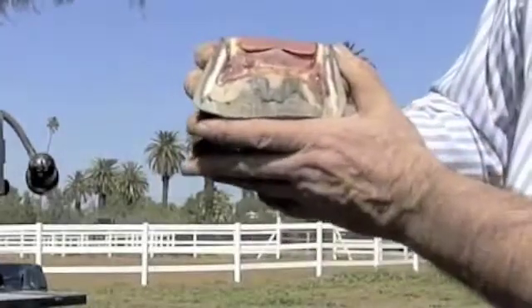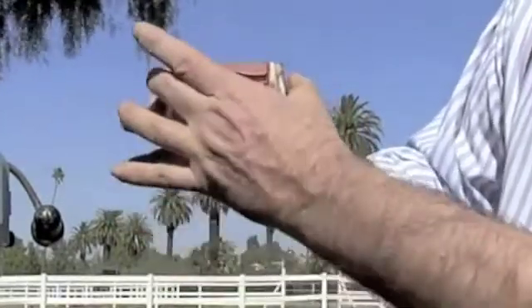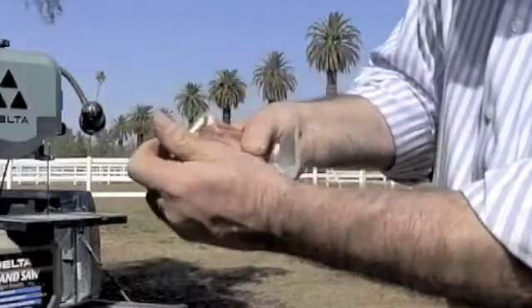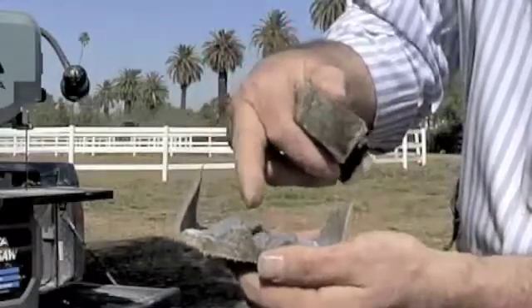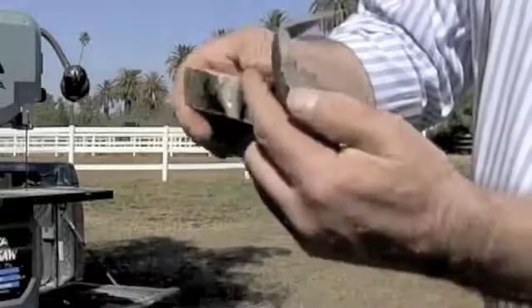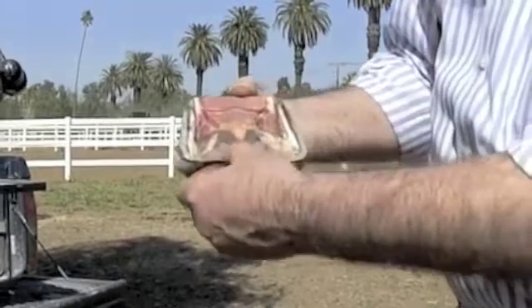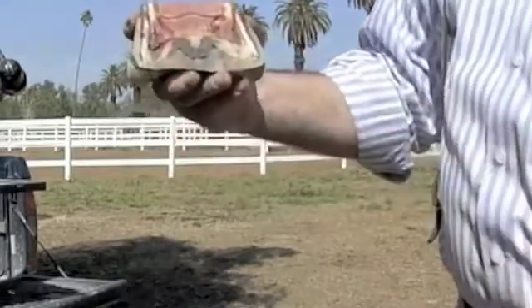We've got great support in the collateral grooves, the sulcus, and the collateral groove walls — we're stabilizing and connecting the walls via the collateral grooves. When we go to take this off, notice it's a perfect match between the cast and the hoof — you can see all the little nooks and crannies, it's an exact negative of the foot. When you put it back in, we're not creating any pressure points because it's a perfect match. Looking at the frog, we have great caudal support covering the whole caudal aspect of the hoof.